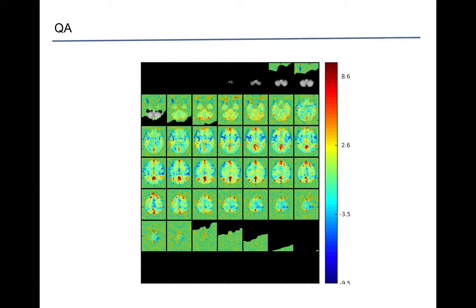So when we look at individual maps from individual subjects, if we have some idea about the spatial pattern of the activation, that actually helps us a lot because then you can use your assumptions and judge whether what you have makes sense or not.